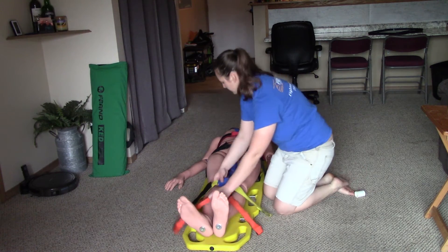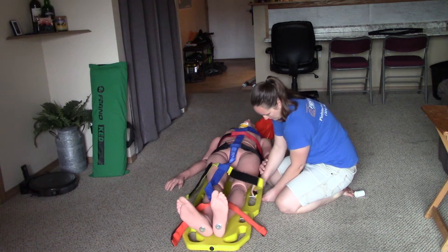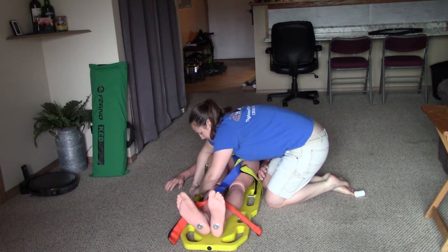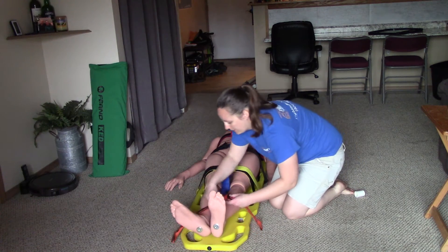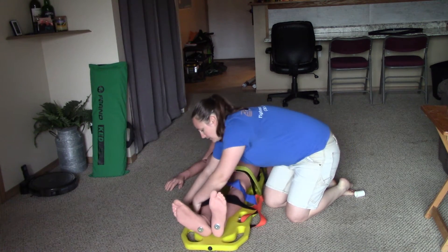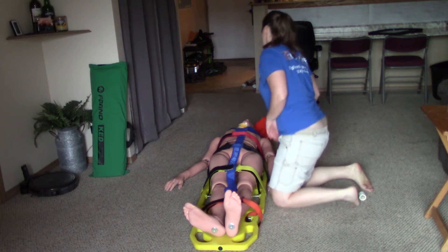The next strap is going to go right across the femurs. I'm putting these on loose and will come back and tighten them at the end. The last straps are going to go right across the lower legs — anywhere across the tibia-fibula is fine. Now that I have all the straps on, I'm going to come back and tighten them.